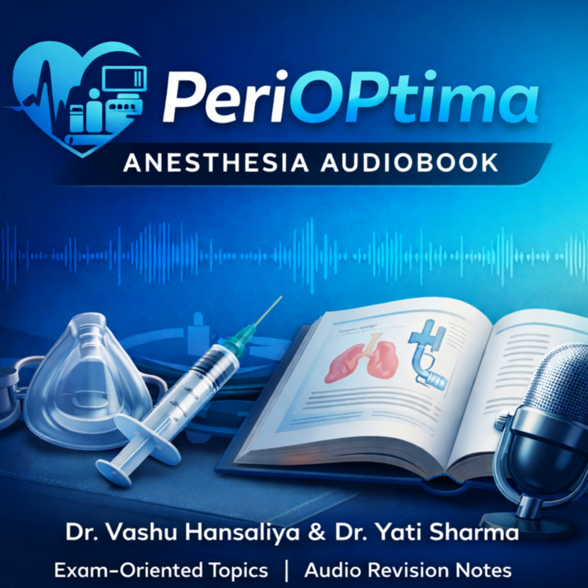Can you break down the physics of that linkage a bit more? How does it guarantee that 25% minimum? Sure. In a modern machine, the nitrous oxide supply pressure is actually routed through a special device that is itself controlled by the oxygen supply pressure. Okay, I see. So if the O2 pressure drops below a critical point, say 30 PSI, that device physically restricts or just shuts off the N2O flow completely. It doesn't matter what the flow meter dial says. It's the ultimate technological safeguard.